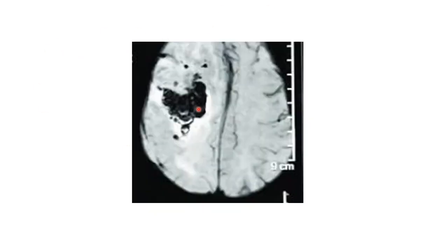So this is a susceptibility weighted image where the hemorrhage is very clearly shown because of the paramagnetic substance which is present in the hemosiderin. It distorts the magnetic field and it causes loss of signal here.